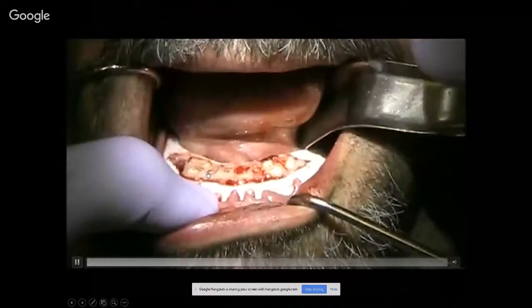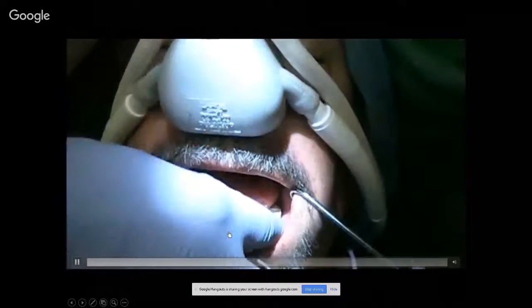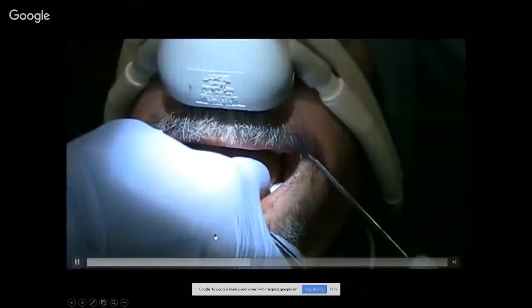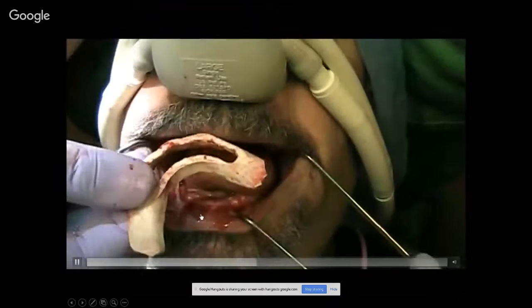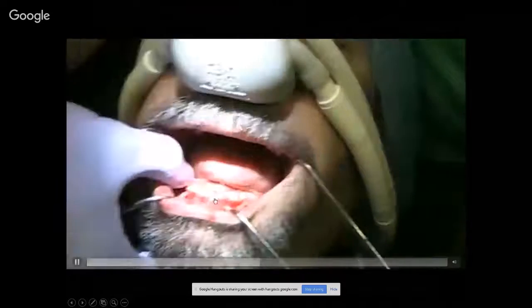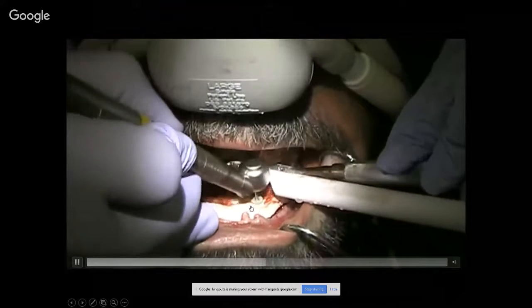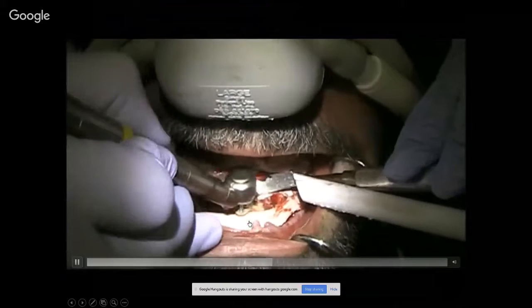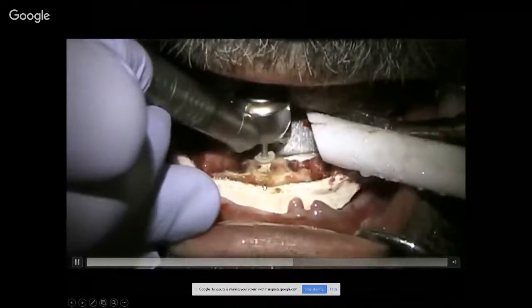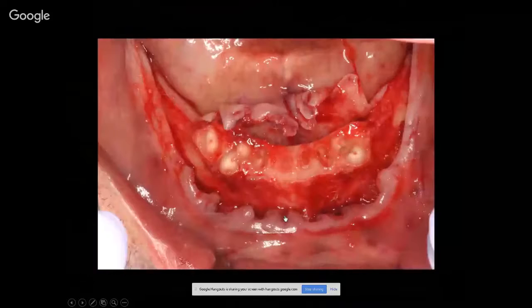So once the teeth are removed, I can better appreciate how much bone I have to reduce for this case. Since this was my first one done 2 years ago, I don't know if you guys saw that or not, but it was pretty evident that the guide snapped out of the patient's mouth. Now I'm just taking a KS9 burr and flattening out the ridge. There's other surgical acrylic burrs that we use on a straight piece now. That's just a closer view of this. I'm going to get out of this and continue on with the lecture.